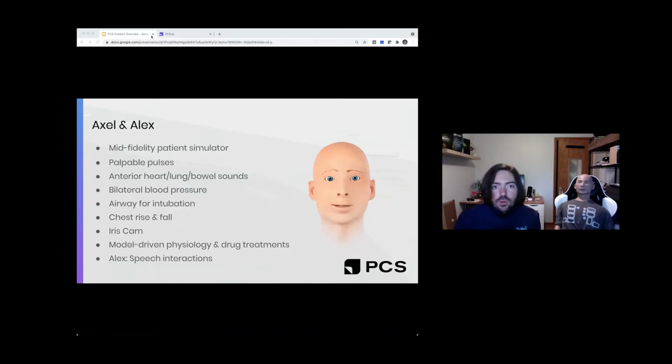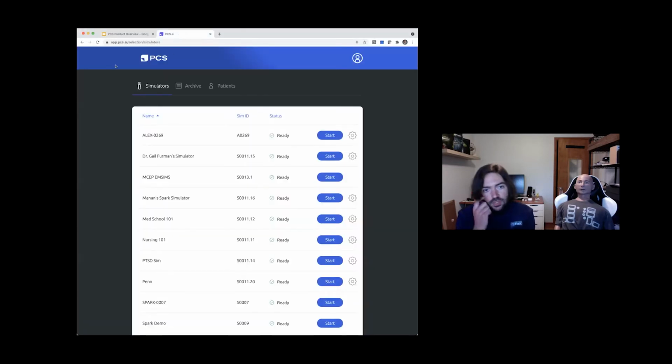So, what I'm going to do now is shift over to our PCS software platform here and go over a brief demonstration on how a simulation with Alex would run. So we have our Alex simulator here, Alex 269. We can see that he's ready to start.